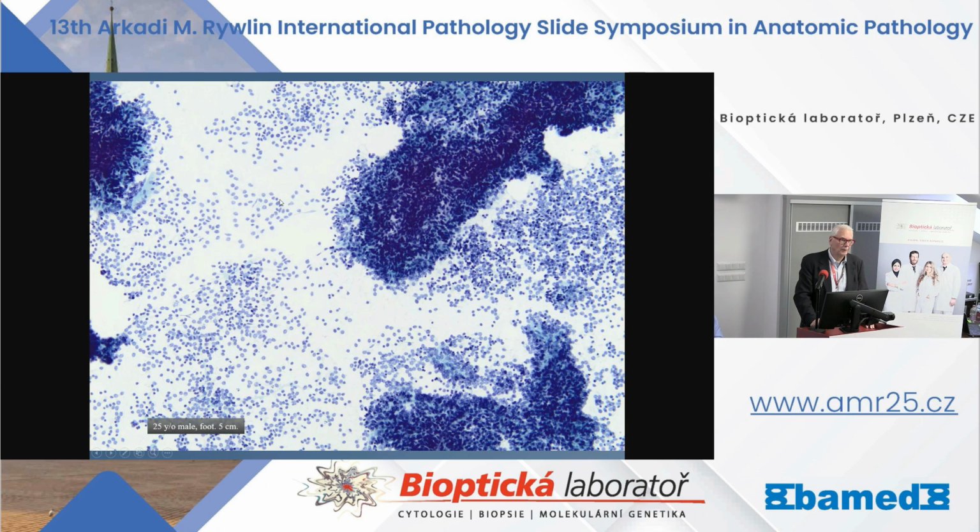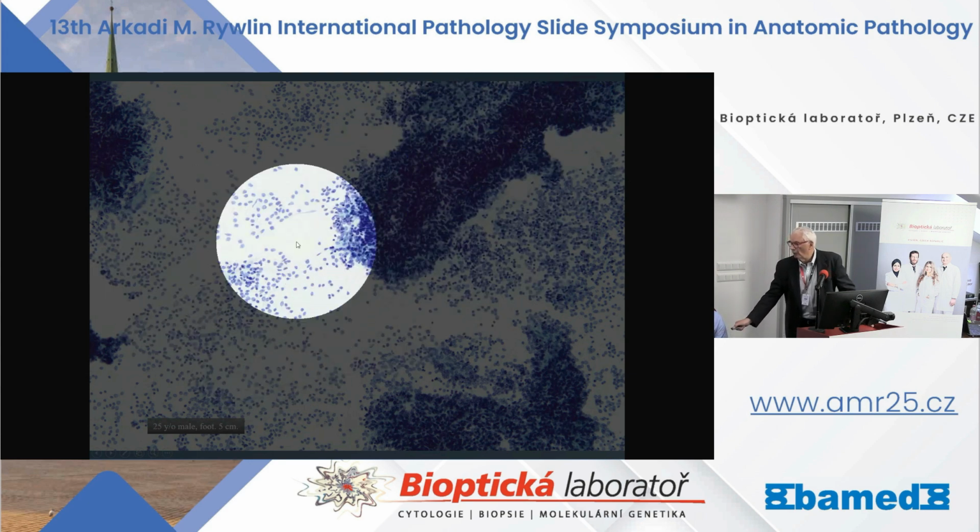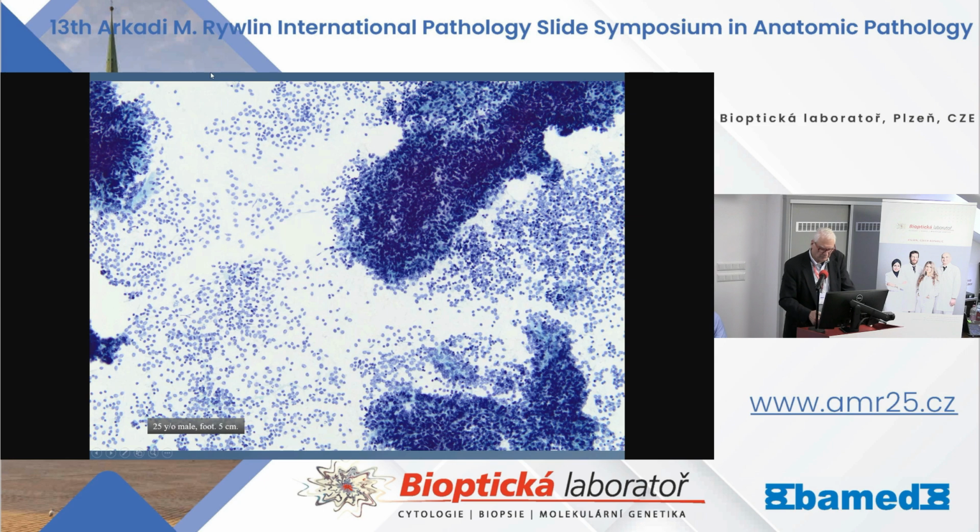When I look at smears, one of the things I look for is cell arrangement, just like you do in tissue. You look to see if there are papillae, if there are acinar structures, if there are cords of cells, if it's a solid pattern. You can do the same thing in cytologic smears to a degree. So this one showed clusters as well as single cells, unlike lymphoma, where you would never see these clusters of cells. You would see a single cell pattern. So I knew I was not dealing with a lymphoma just on looking at this Pap stain.